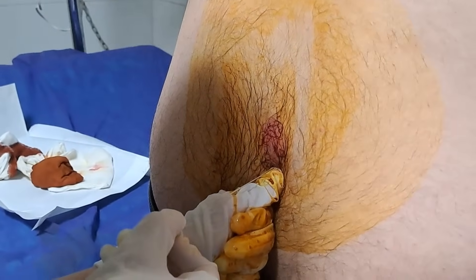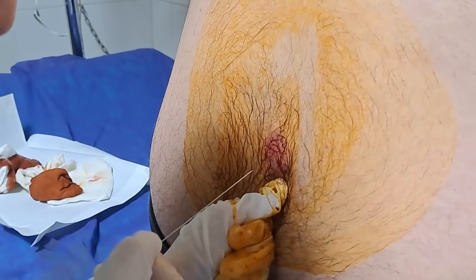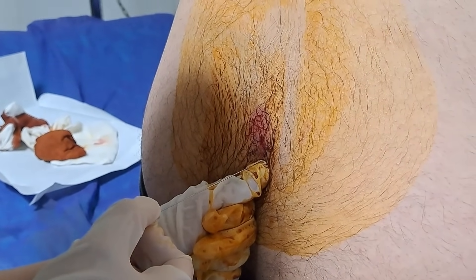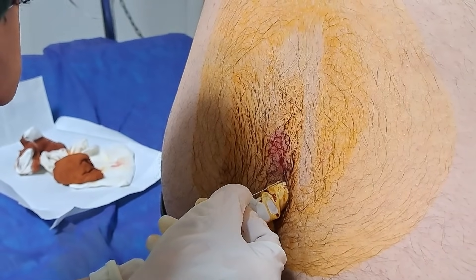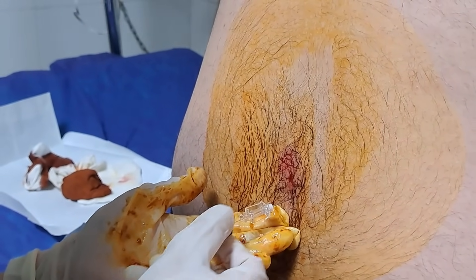A needle is carefully inserted between two lumbar vertebrae, typically between L3 and L4 or L4 and L5, to avoid damaging the spinal cord. This is sometimes harder in obese patients, so you may have to try several times to access the right point. Like in this patient, it took us three attempts to find the right point.